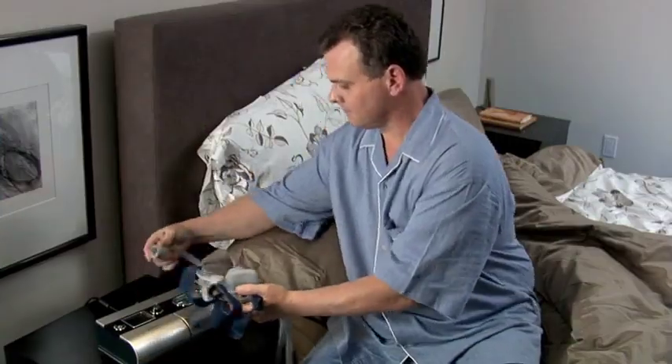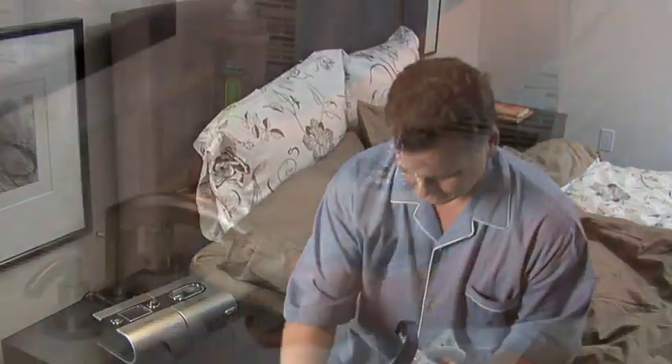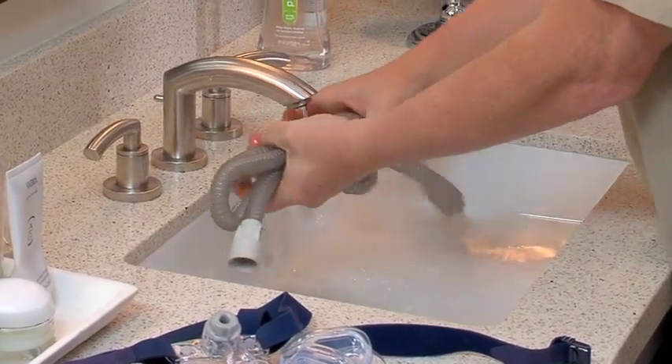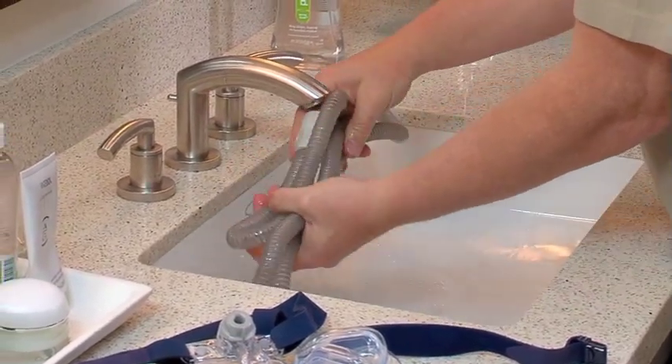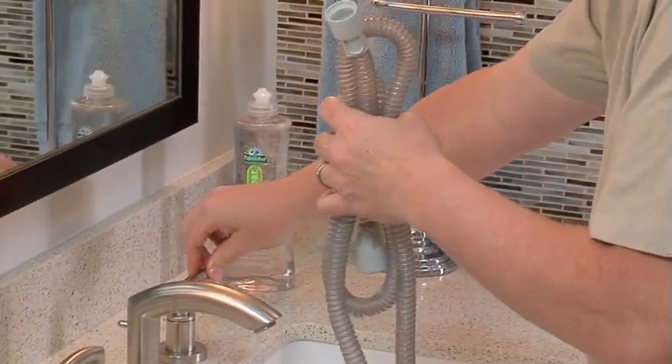On a weekly basis, remove the air tubing from the CPAP device and your mask. Next, wash the tubing in warm water and mild detergent, then rinse thoroughly with water. Hang it and allow it to dry. Before your next treatment, reconnect the air tubing to both the air outlet and mask.